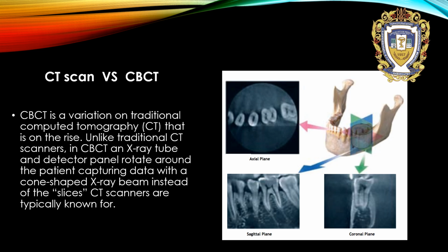But nowadays in medicine there is CBCT, cone beam CT. What are the differences between CT scan and cone beam CT, and the advantages?